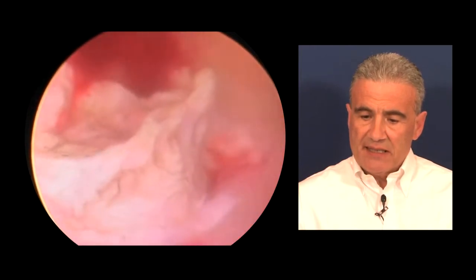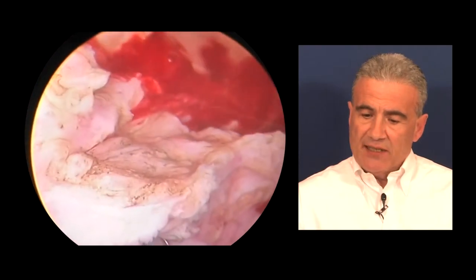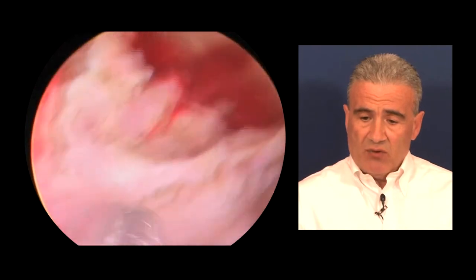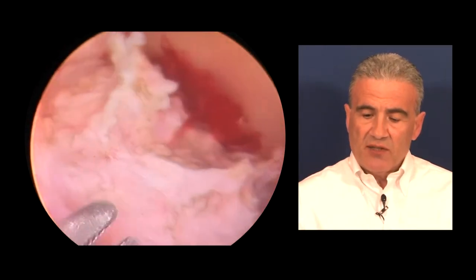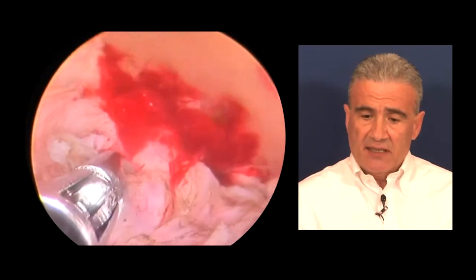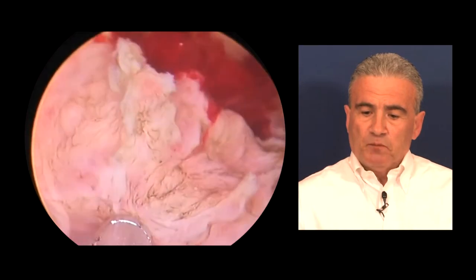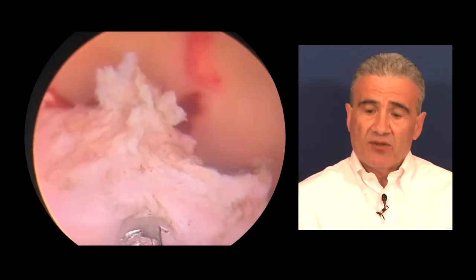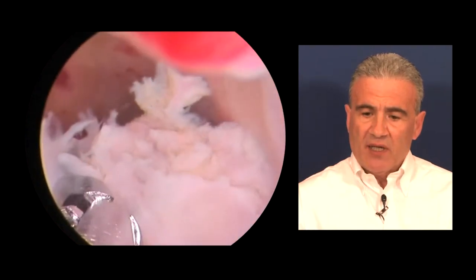Now we see that by using the dissector — the dissecting forceps of the operating system — the enucleation of the intramural portion of the myoma has begun by peeling at the level of its pseudo-capsule. The mechanical action of this instrument is very similar to the action of the resectoscopic cold loops. In addition, it provides the advantage that the myoma can be taken with the clamps of the instrument and that a certain strength and traction can be applied in the direction of the uterine cavity. We observe how the entire intramural part of the myoma protrudes and starts to occupy almost the entire uterine cavity.